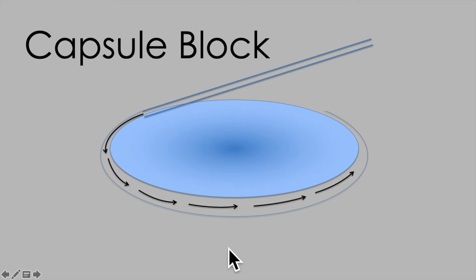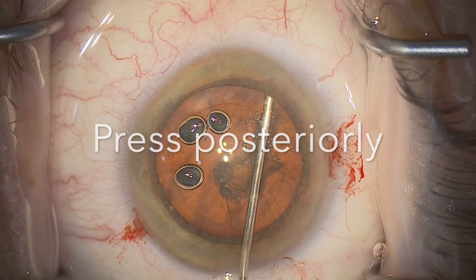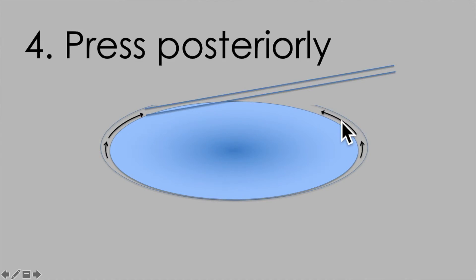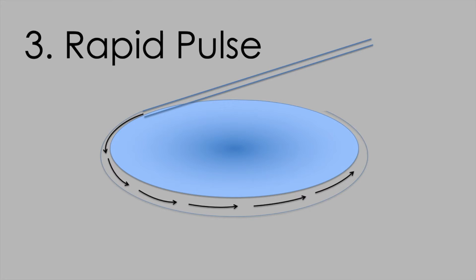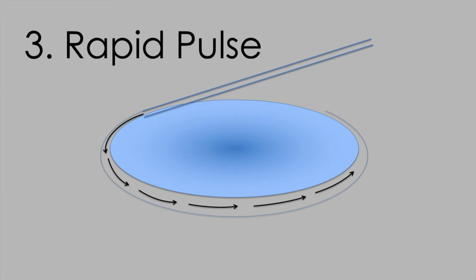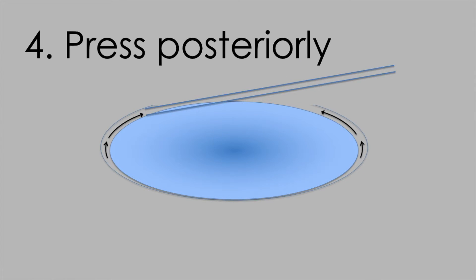Once the hydrodissection front has moved across around the back of the lens distending the capsule, the lens rises into the rexis and you've got a capsule block situation. You're then ready for stage four, which is to press posteriorly and neutralize the capsule block, bringing the fluid around from the back underneath the anterior capsule to complete the hydrodissection. You can repeat the rapid pulse and pressing posteriorly, blotting the nucleus backwards and forwards like this to confirm a complete and free hydrodissection.